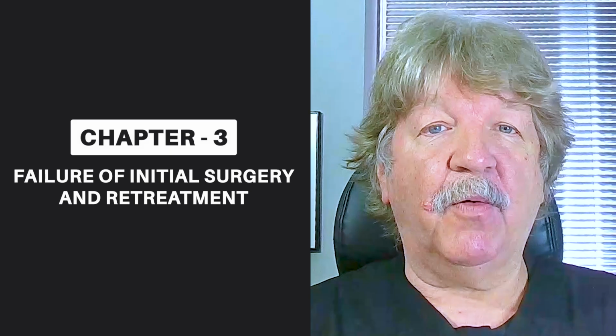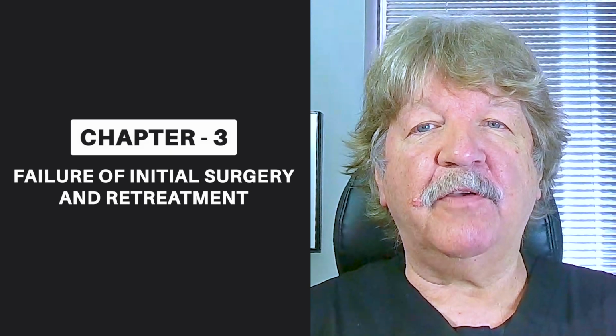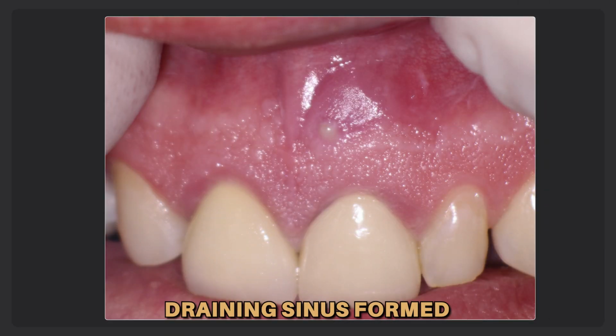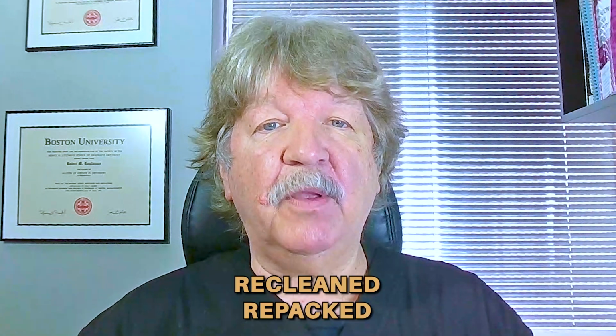Things seemed to be going well until March of 2023 when Arnie returned with a localized swelling over the labial root surface where I had performed the repair. Eventually, a draining sinus formed, and I was at a loss to explain why my surgery had failed. I discussed the case with another local endodontist, and we agreed that the post should be removed through the crown and the coronal aspect of the canal should be re-cleaned and repacked to ensure that we weren't getting coronal leakage into the area of the surgery.